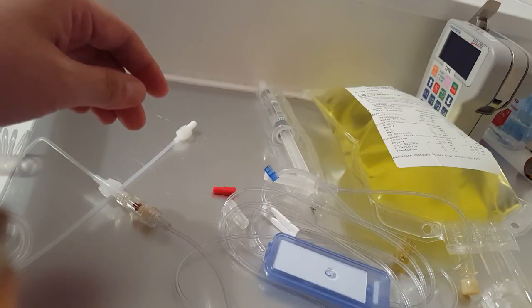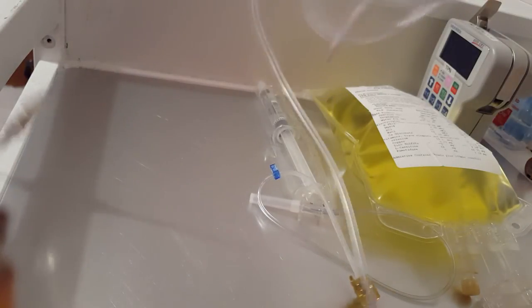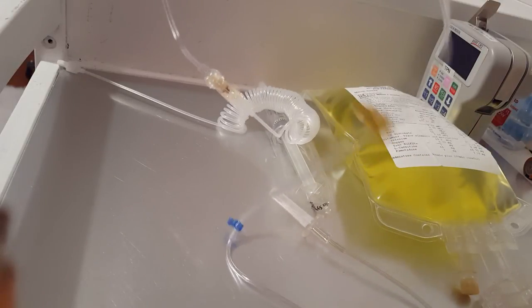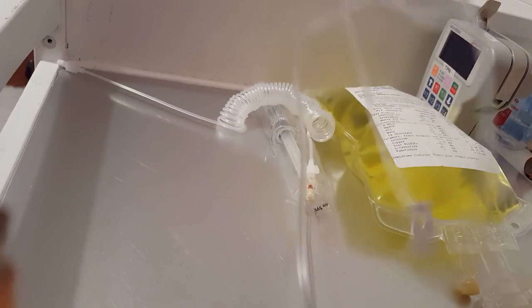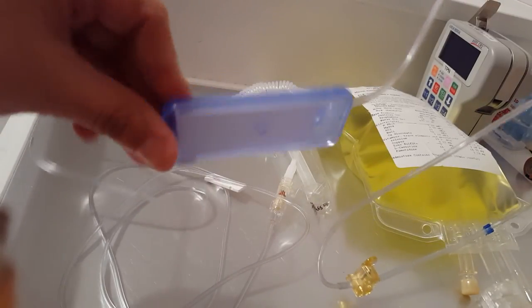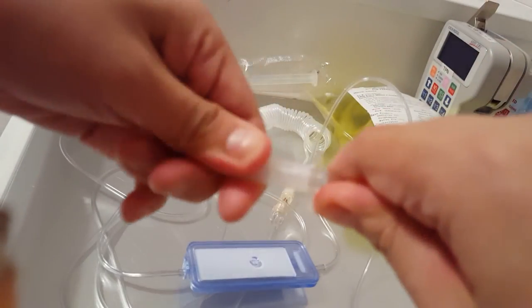Once my cables are connected, I check that everything is good — no holes or cracks in the cable. Then I plug it into the bag. In the past I've plugged the bag in first and then accidentally contaminated it while connecting another cable and had to restart all over. So now I connect the cables first. I semi-open this a little bit and then when I'm ready to connect the bag, I open it fully.